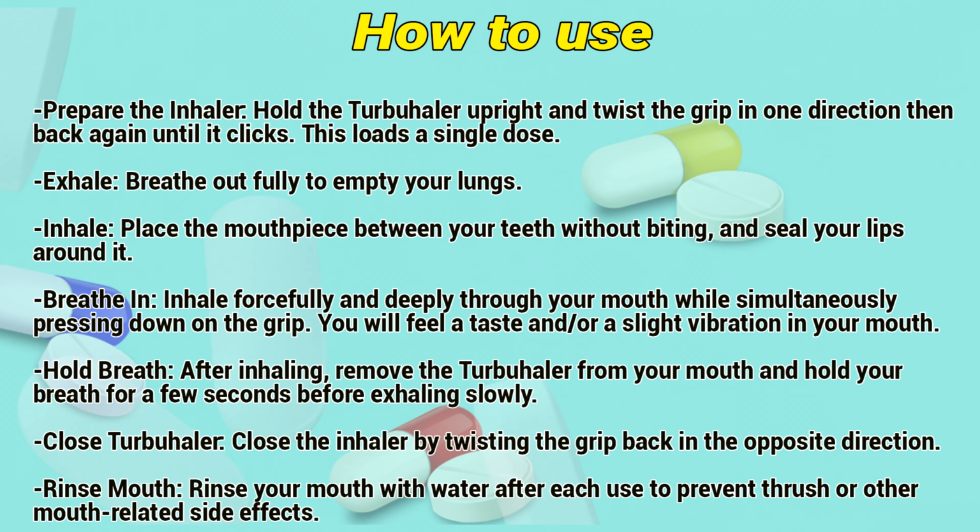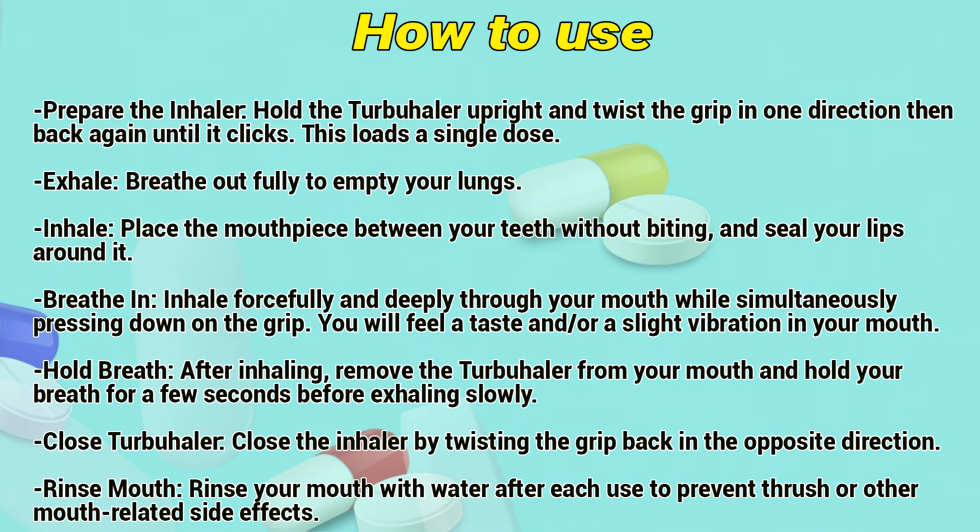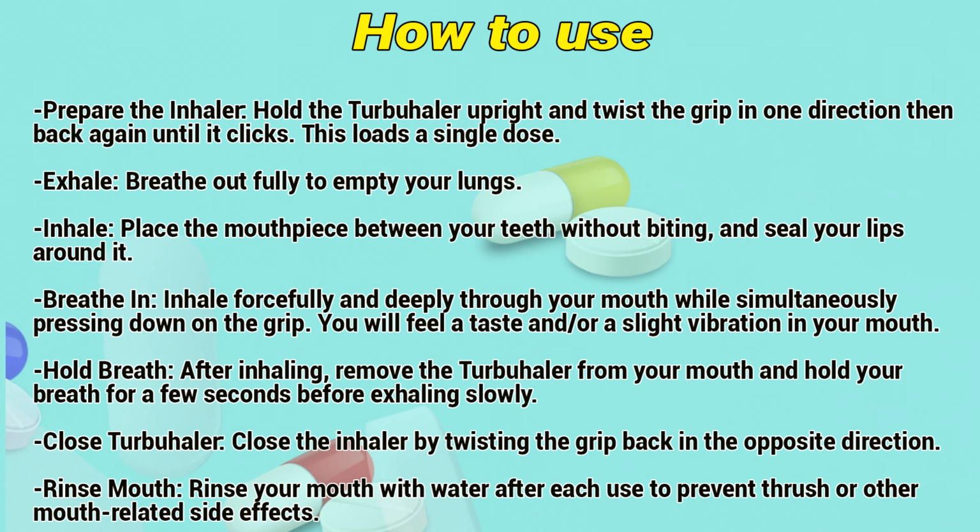How to use: prepare the inhaler. Hold the Turbuhaler upright and twist the grip in one direction, then back again until it clicks. This loads a single dose. Exhale, breathe out fully to empty your lungs.